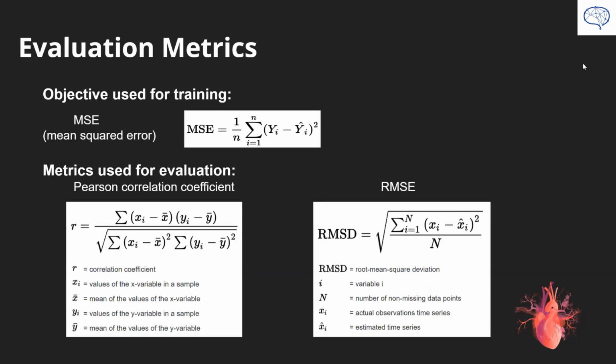Yes, so for all the 5 aforementioned models, we use the same and most commonly used loss function, i.e. the mean square error, which performs good enough for us. And we have 2 additional metrics for the accuracy of reconstructed signals. To measure the absolute differences between the reconstructed and original signals, we use the root mean squared error. And to measure the relative differences, we use the Pearson correlation coefficient.